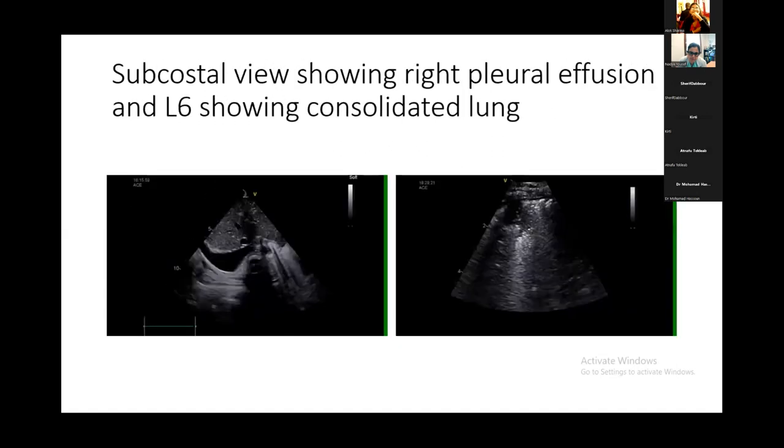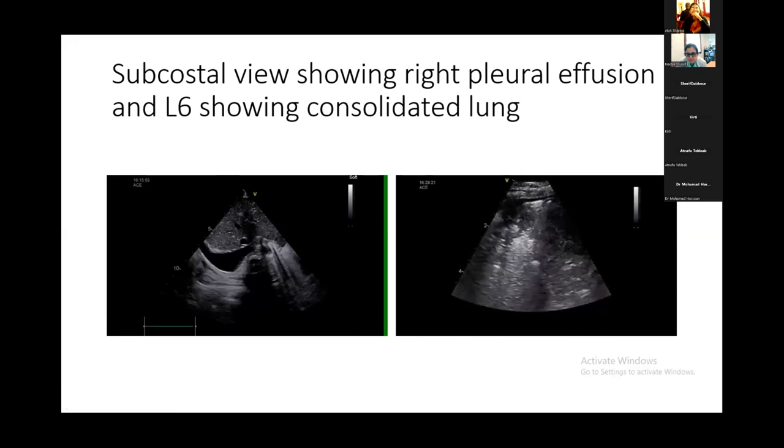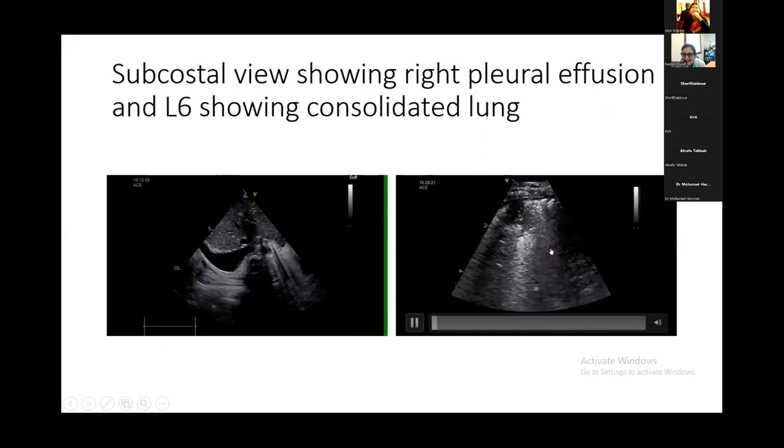This one or this one? So, may I ask, this hyperechogenicity, is it in favor of consolidation in the right image? Yeah? Or Dr. Nadya? Oh, it's for me. Sorry, could you get the clip to move? Which hyperechogenicity? You mean this one? Just below, in the middle of the image. Yeah, I see.